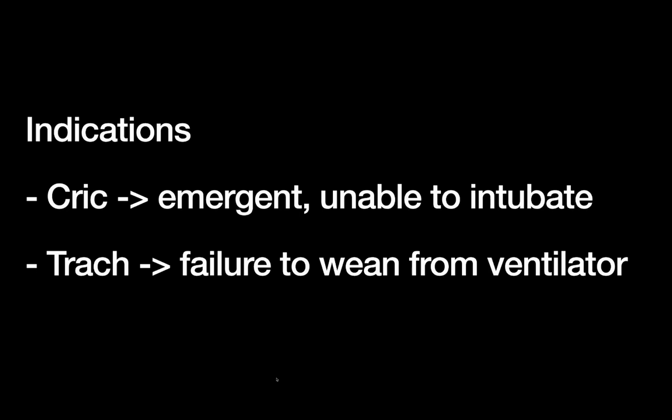All right, so why would we use these surgical airways? We'll talk about the less common one first. A cric is quite a rare procedure. This is really only used when anesthesia or somebody trying to intubate a patient is failing, and the patient is rapidly decompensating or desatting, and you just need to get access to that airway as soon as possible.